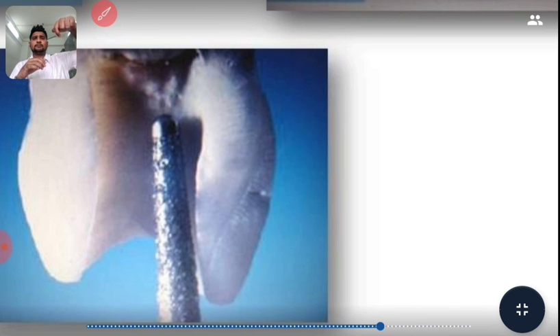So I always do this because it's like this room and we have to remove the roof. So you put the chamber, feel the roof, where the roof is. So the roof itself, the chamber itself is guiding you.